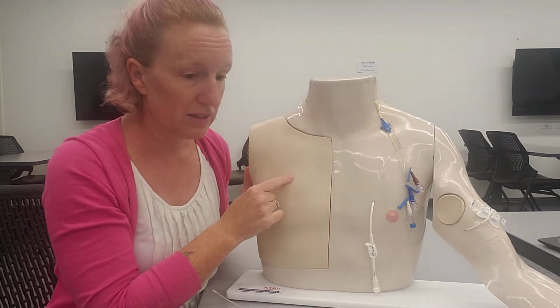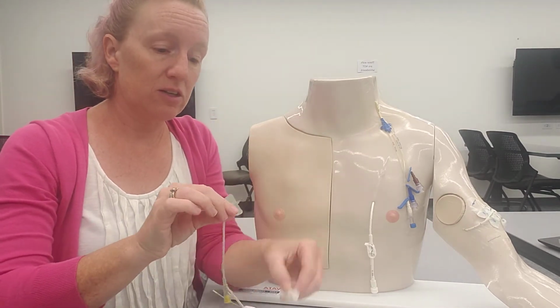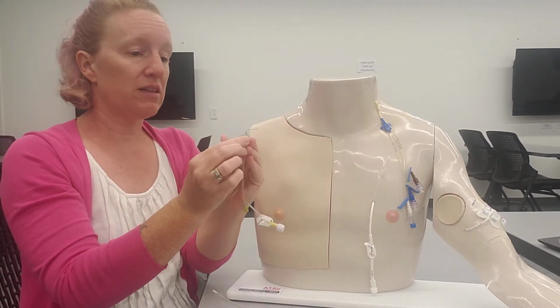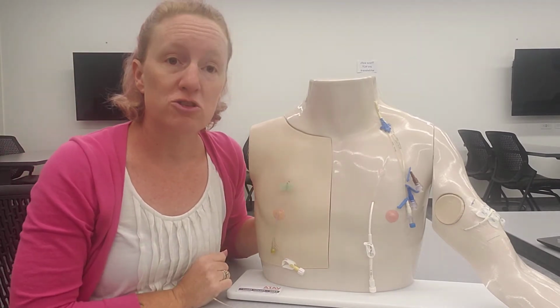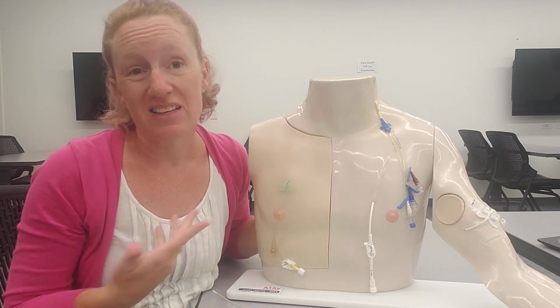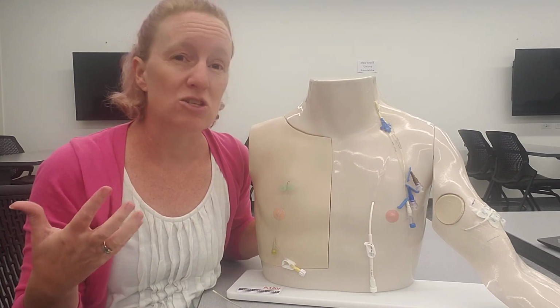We can put a needle in here. It's called a Huber needle. I've got an example of one here. It kind of looks like a little fang claw tube thing. You take this and you would put it with a sterile procedure directly in the space. Remember, this is going to be a registered nurse that's going to do this, and usually a pretty good trained one, because again, a port is not something we see commonly in patients that don't have chronic conditions.